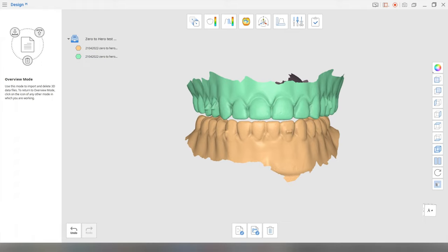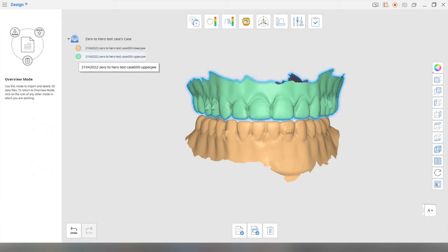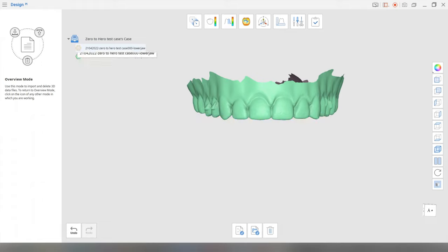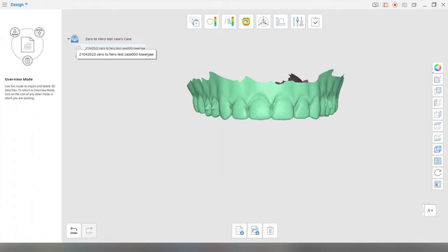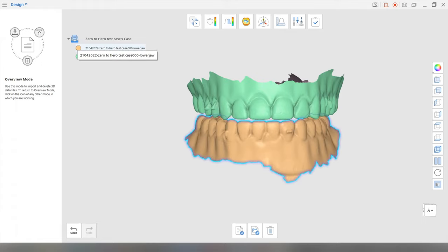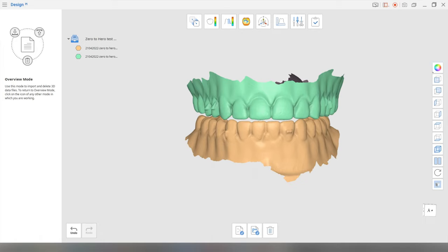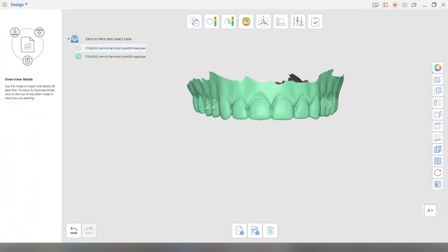Okay, now first things first, we're going to design a splint for the upper. I'm going to hide this lower jaw and you just basically left click this lower jaw icon over here. Before I start, if you want to choose the color, you can change it over here. All right. But anyway, I'm going to hide this over here.